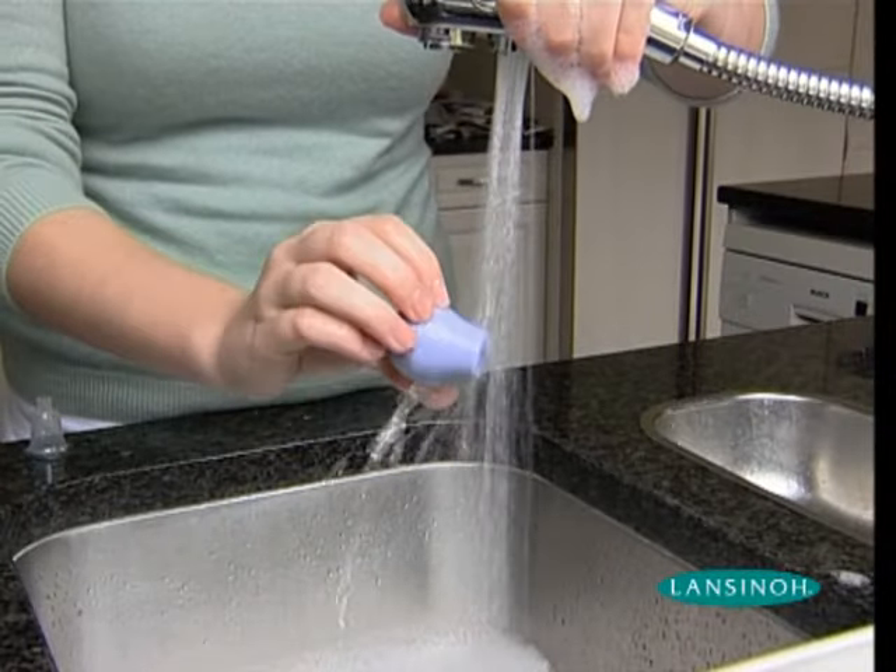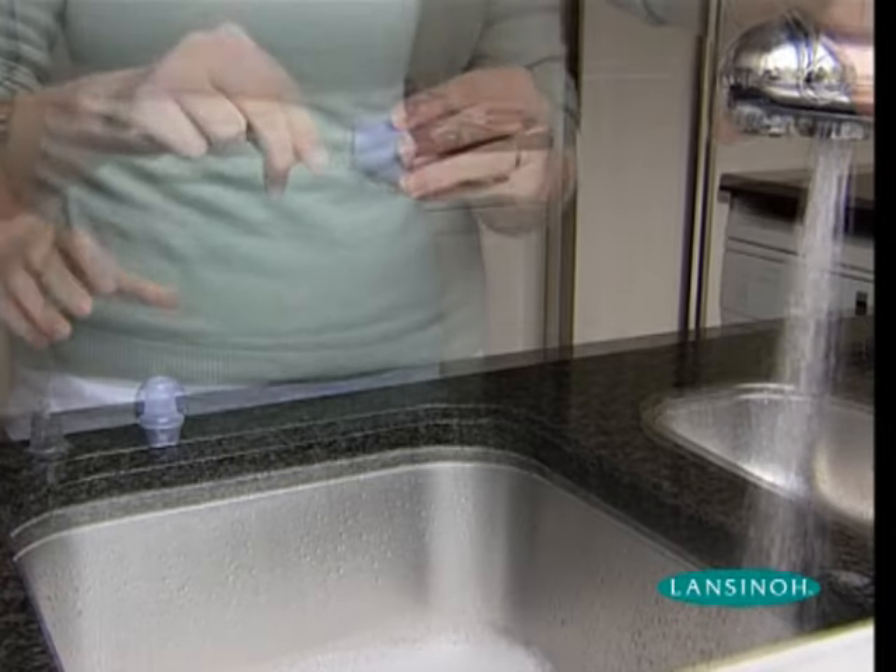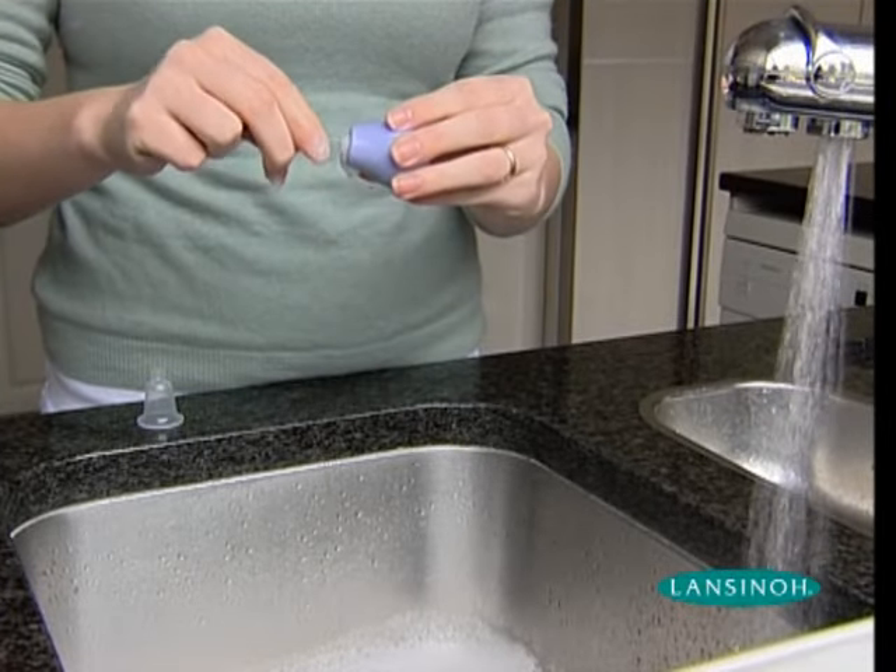After use, wash or sterilise the Latch Assist again. Rinse and air dry. A small bottle brush is useful for cleaning the inside of the bulb.